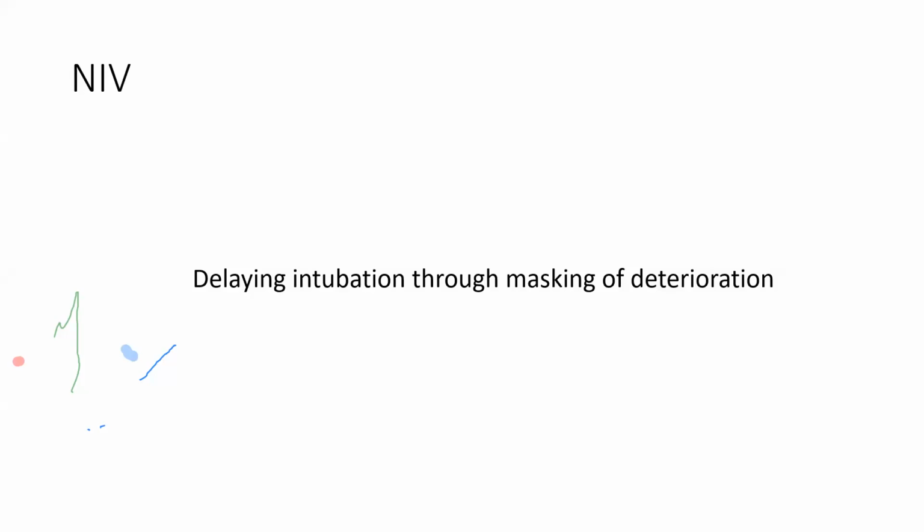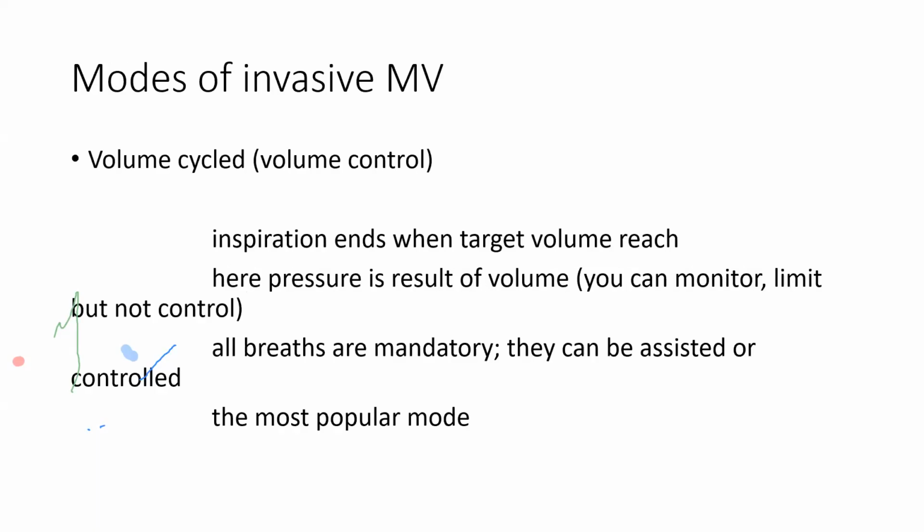So this is for non-invasive mechanical ventilation. So if a patient is suitable on non-invasive mechanical ventilation, in short, he can get a trial. The trial should not be more than 2 hours, very initially, very well monitored, and with low threshold for intubation. Should you feel that the patient is not benefiting, is not obviously improving on non-invasive mechanical ventilation, then do not delay intubation.